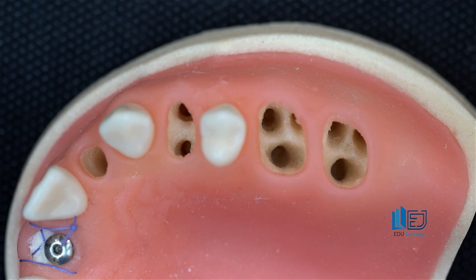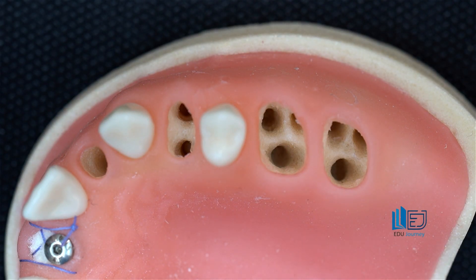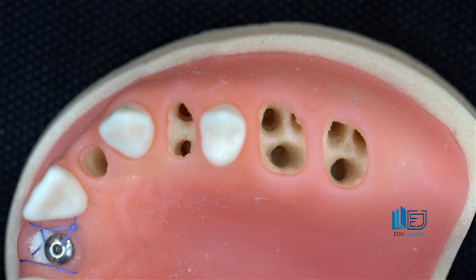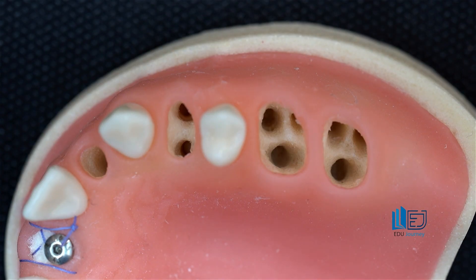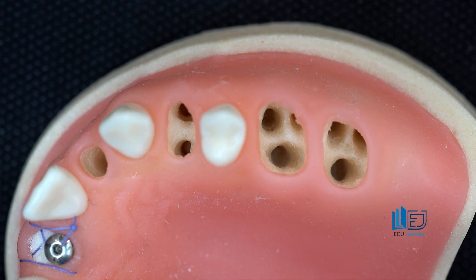Regarding the correct drilling point, in almost all posterior teeth, the furcation — right in the middle of the tooth — is the correct area to start drilling. For the upper fourth tooth, the correct point is slightly toward the palatal from the furcation point. For the upper sixth and seventh teeth, it's exactly at the furcation, and for the lower sixth and seventh teeth as well, it's exactly at the furcation — right in the center of the tooth crown — which is the correct point for drilling and, ultimately, for implant placement.